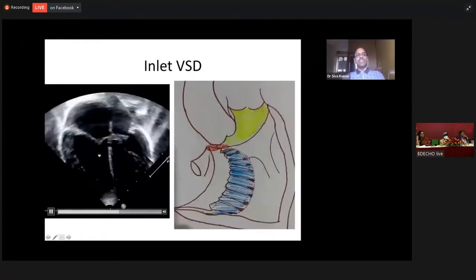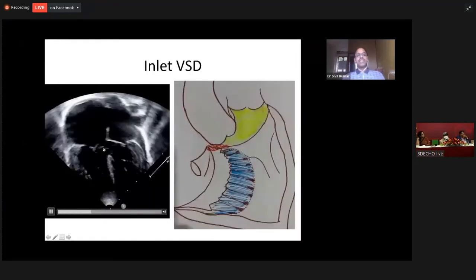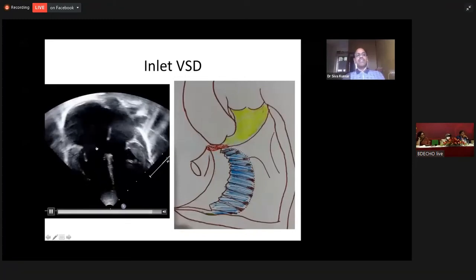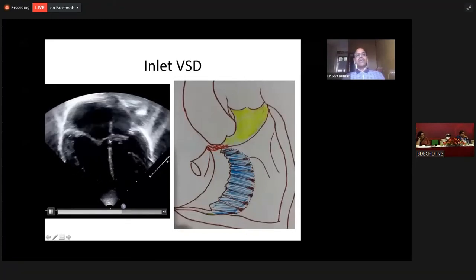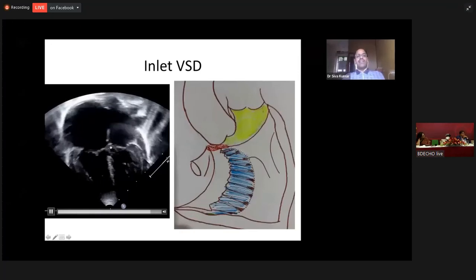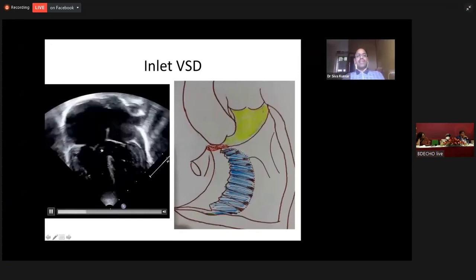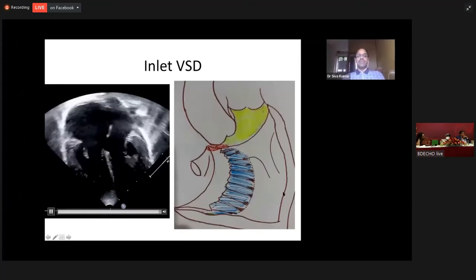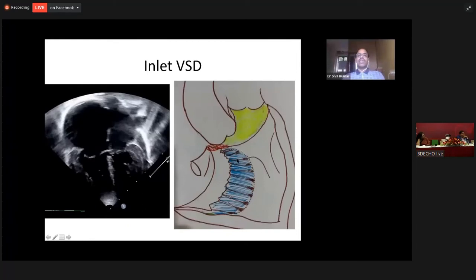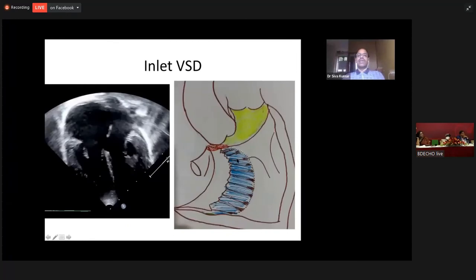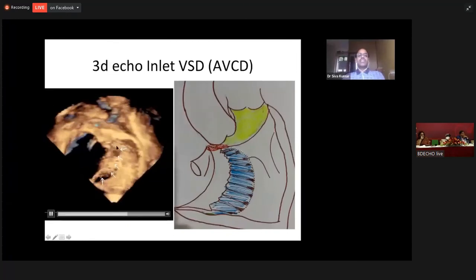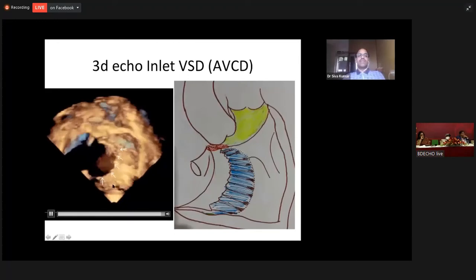The last form of VSD is the inlet VSD, which is also called the AV canal VSD. You can appreciate between the AV valve annuli is the inlet ventricular septal defect, drawn in this cartoon in blue. And the same thing is seen on three-dimensional echocardiography — this is the inlet ventricular septal defect.